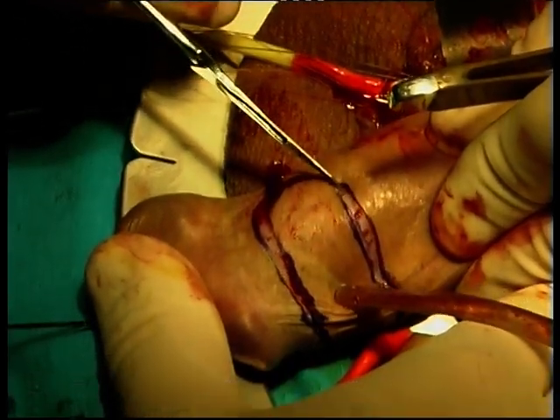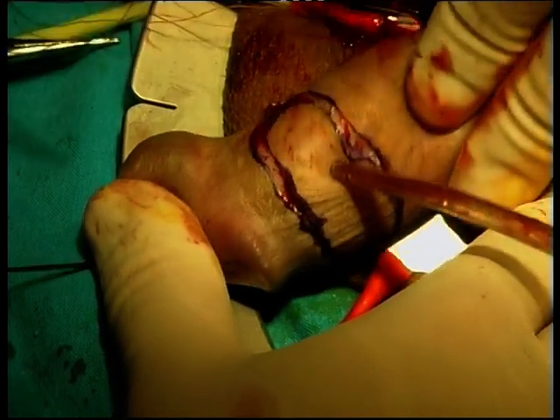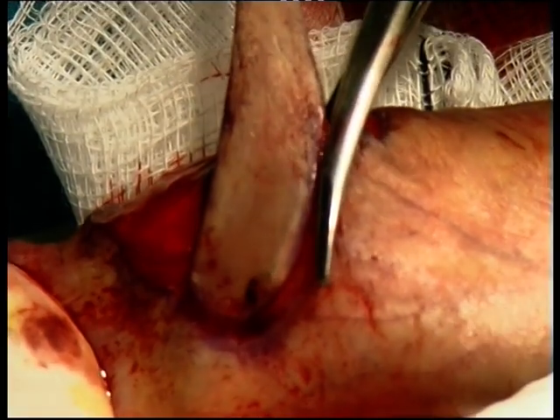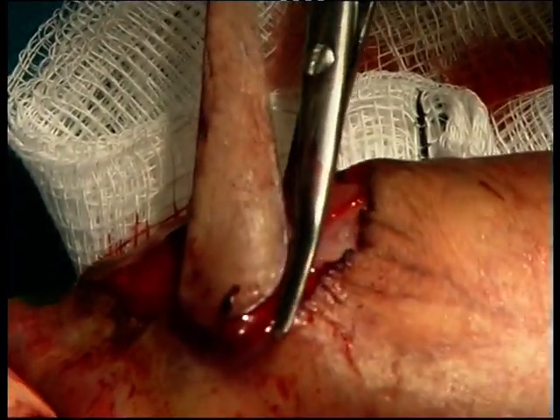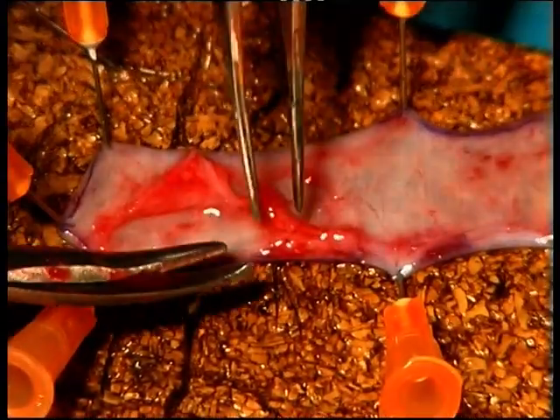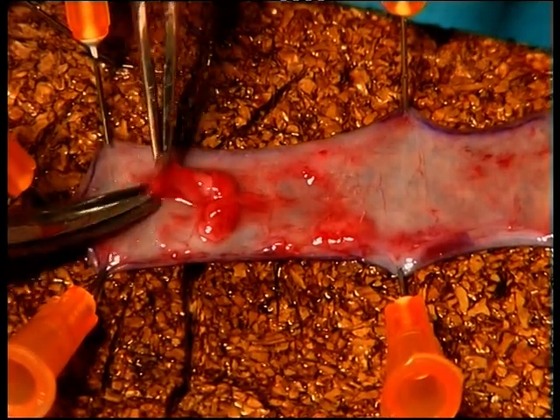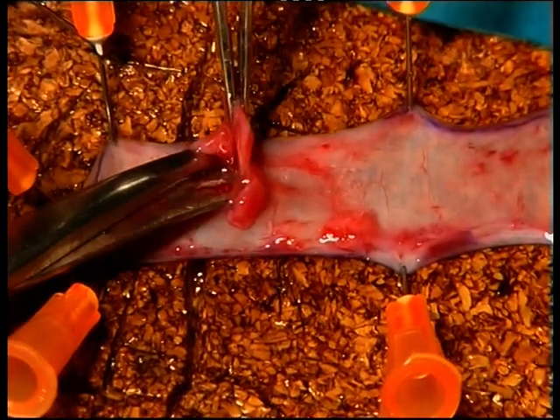This technique allows us to keep the prepuce and use it in the future in case a further urethroplasty is required. The graft is stabilized with 26-gauge needles on a board where it is defatted to improve the chances of neovascularization. During this procedure it is convenient to irrigate the field with normal saline to avoid tissue desiccation.